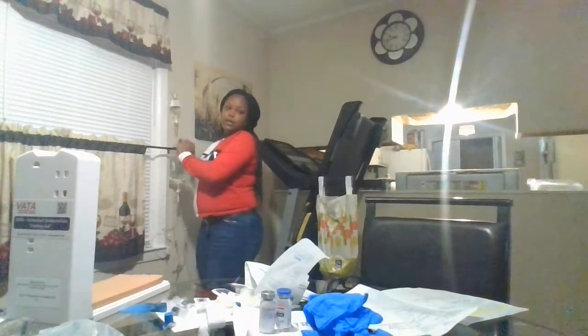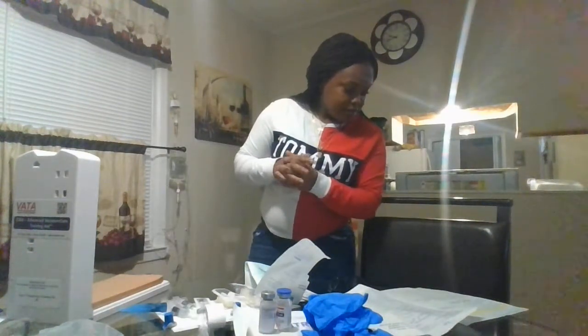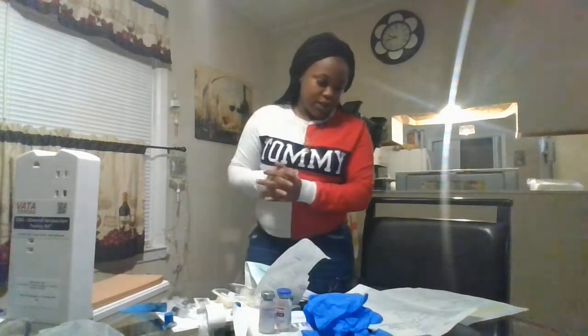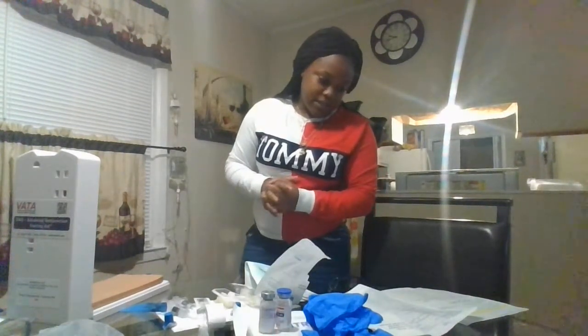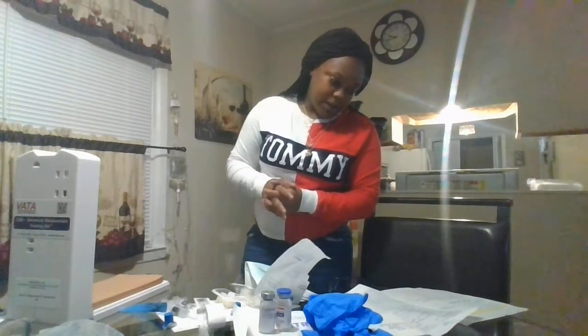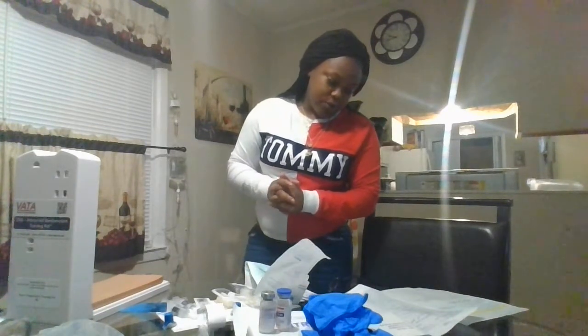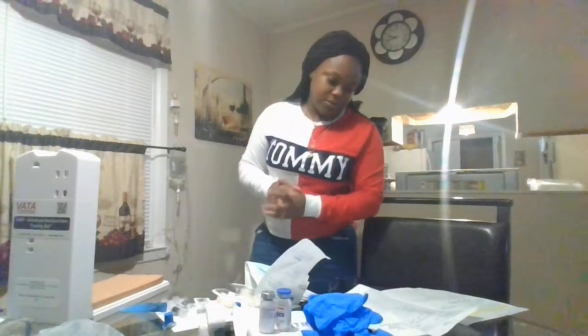All right, Mr. Jack, I'm going to wash my hands at this moment and put on my gloves. Again, checking my MAR to make sure it's the right patient. Jack Smith, 11558. Allergies to penicillin and aspirin. You're getting today normal saline 500 at a rate of 75 cc's an hour. You're getting an antibiotic at 475 milligrams every 6 hours, and then your diuretic I told you about, your furosemide.